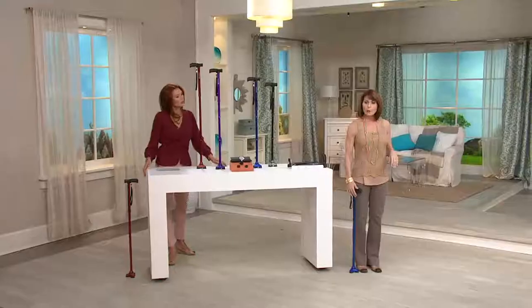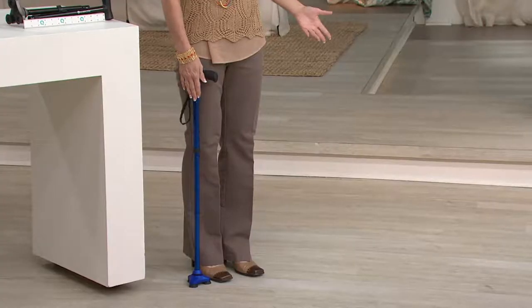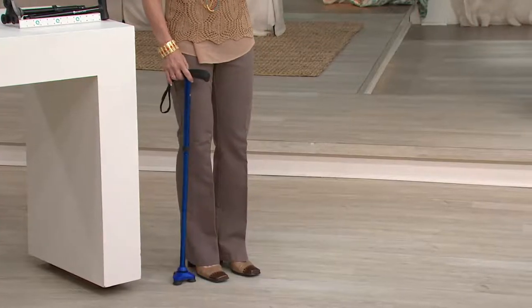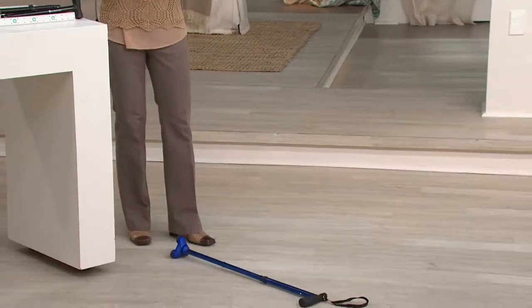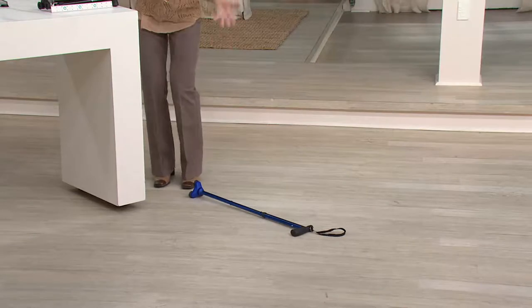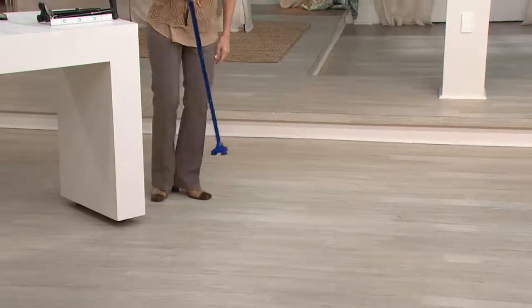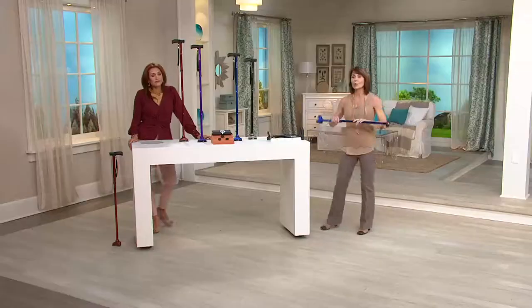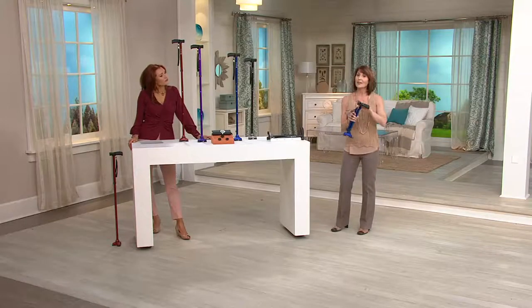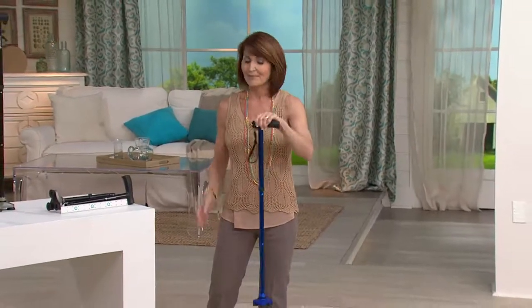When you get this home, you want the cane to be at approximately your wrist's height when you're standing. If the cane should ever tip over, don't worry — if we need a cane, the odds of being able to bend down and pick it up are slim. Just take the ball of your foot, apply a little bit of pressure, and you can bring the cane right up to you. In the event it tips over or someone knocks it over, you can use the ball of your foot to pick it up.